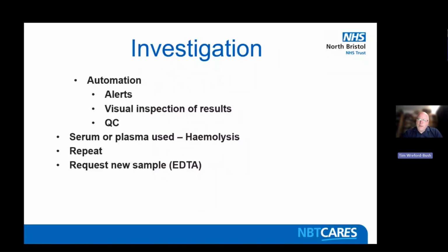This is another interesting one. We normally use EDTA. So EDTA deactivates complement, along with a few other things. With serum, you may get the C3D, and that can cause hemolysis, certainly in the reverse group. Some I used to see as a young BMS, but we've all moved to EDTA, so we don't normally see that so much in the labs.